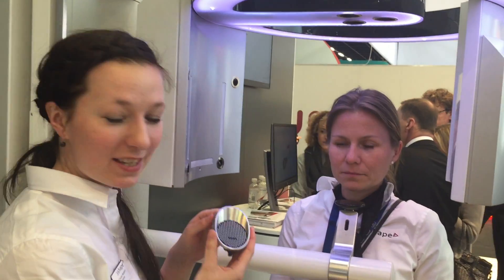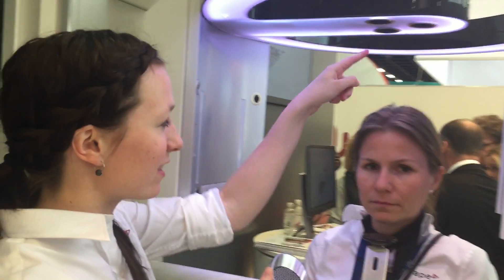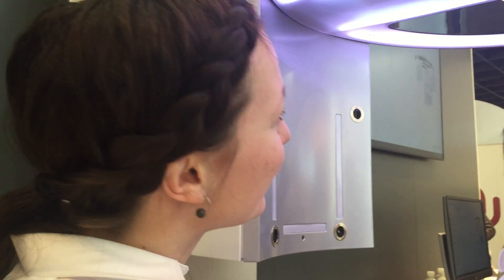So what we're doing now, we have this object that we see by these cameras. Because we can motion-compensate, meaning that we can correct for the movements any patient makes.